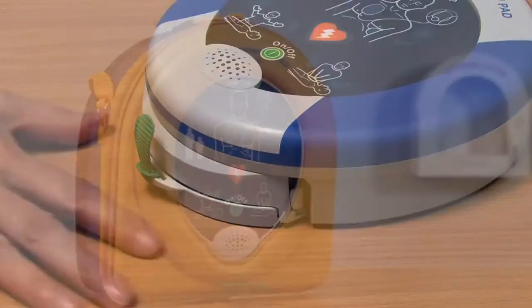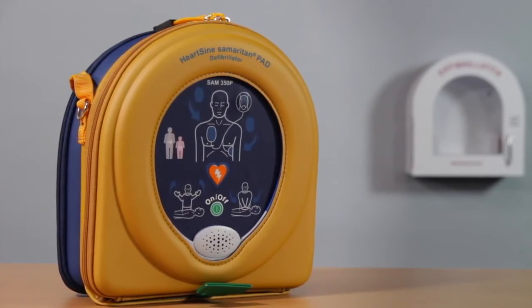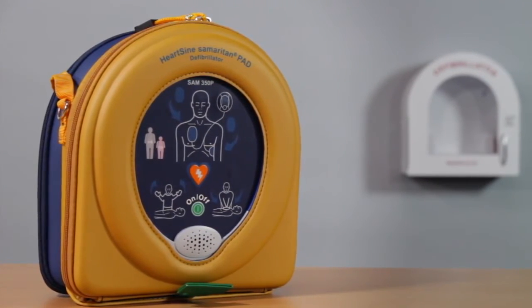Once a new pad pack is installed, place the Samaritan PAD back in the case provided. Follow your local battery disposal guidelines for disposal of the pad pack.